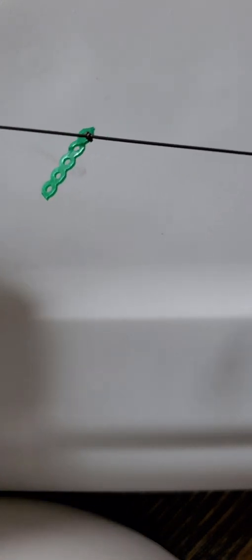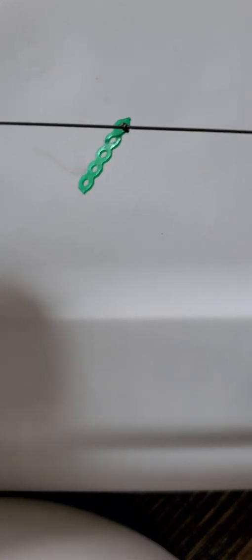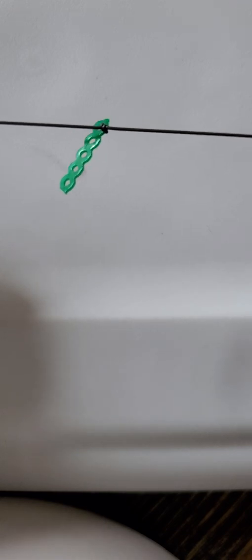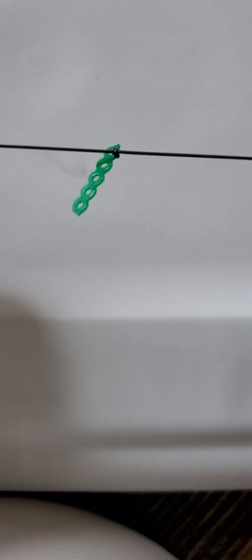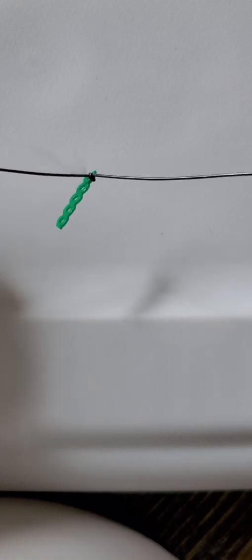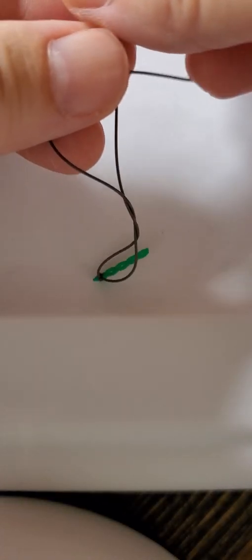So anytime you want to tie it to something, you can tie it to an eyelet, you can tie it to a gold chain and an exposure, you just need to thread it through and you just need to tie it tight. Usually I do two knots, one and then the next. So I'm going to show you here how I would tie it.